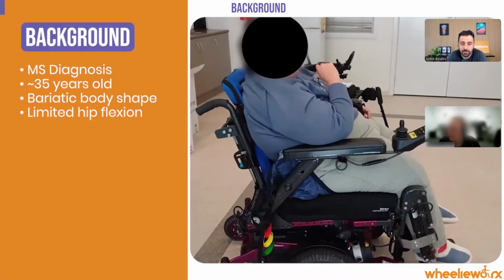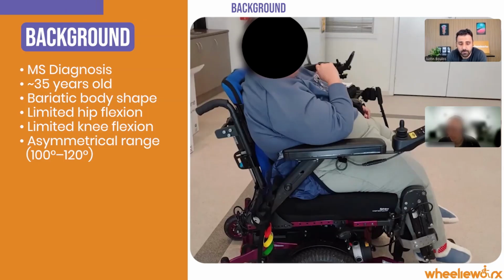But she had limited hip flexion, knee flexion. So we cannot get the knees past about 110. And the hips are about the same. Both hips, or really one hip? Both probably, and one's 110 or one's maybe even closer to 120. Like it seems to just progressively be getting harder.